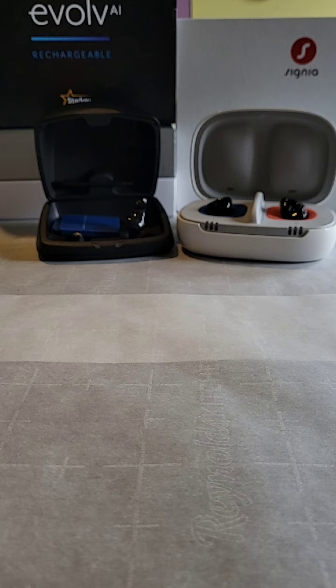Now, when someone says something like, hello, Darren, right after Darren, I hear a quick sound after the hello, and that, again, is the processor and the compression. I think it's that latency that we hear, and I could live with that. Usually if it's a conversation going, I don't even notice it. But if it's real quiet and maybe I just drop a pencil or something and I'm all alone, then I'll hear that pencil hit and then a quick sound.